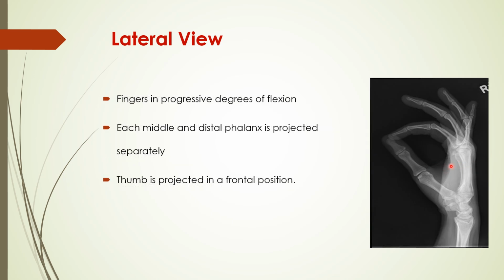Another thing to notice is that the fingers are in progressive degrees of flexion. So each middle and distal phalanx is projected separately and we can assess them individually. Also, the thumb is projected in a frontal position.